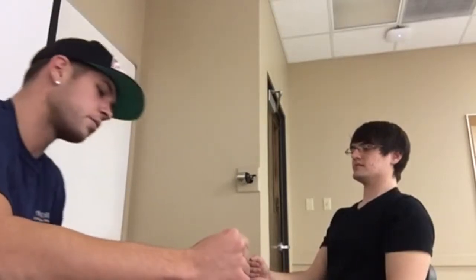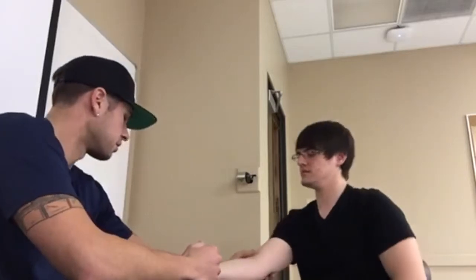Next, you're going to explain the testing protocol to the patient. So first, I'm going to have you sit regularly in your chair with your feet flat, back all the way up on the chair, and then I'm going to have you put your right arm rested on the table, and not completely rested, so you're not having to put any force or anything to hold it up.